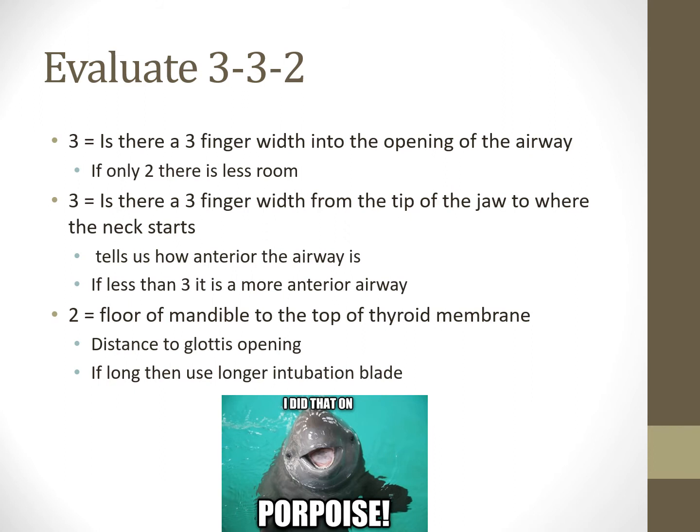If there's only 2 or less room, that might be an issue with the jaw opening or the ability to open the airway, and we might have to do a video intubation, like with a bronchoscope or one of the other video intubation systems out there.